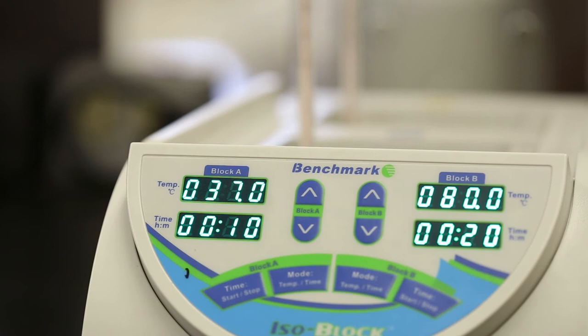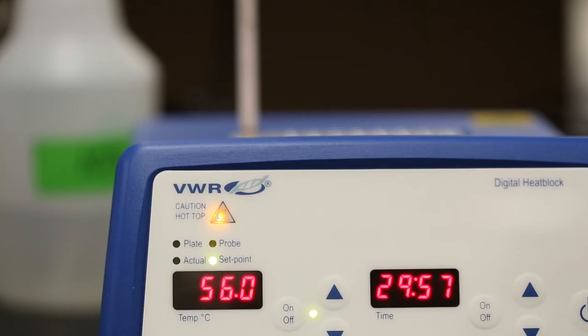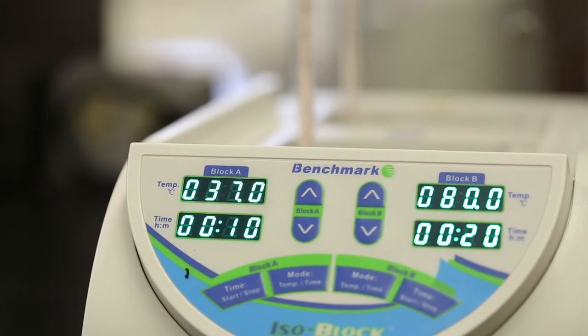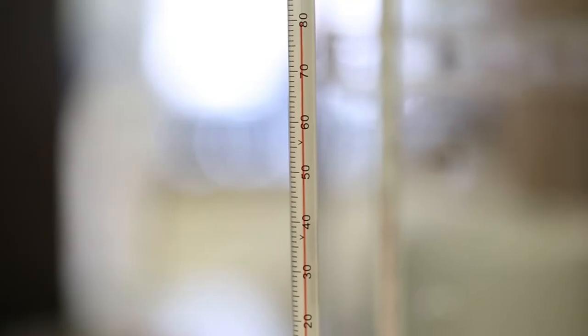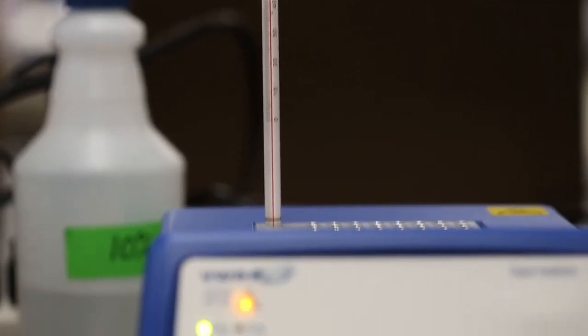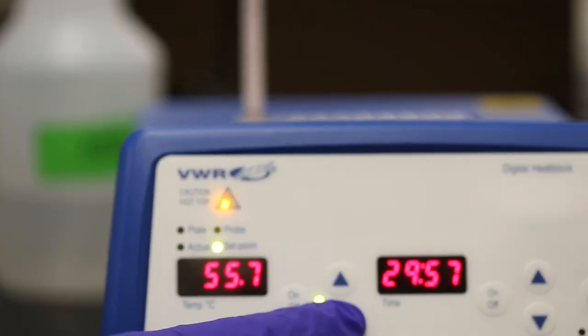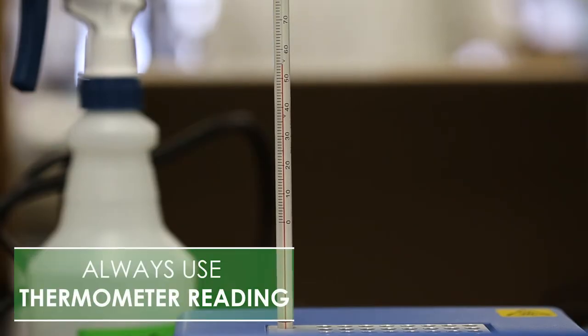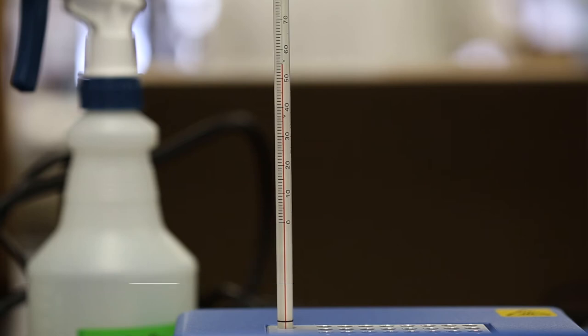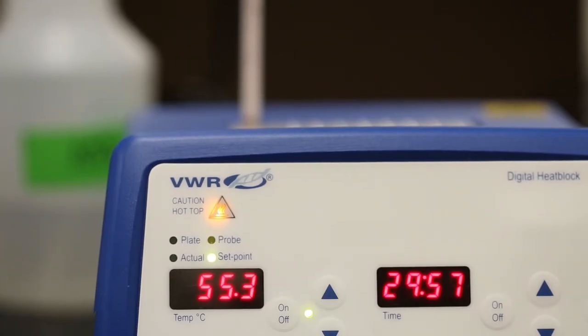Check the three heaters. They should read 37 degrees, 80 degrees, and 56 degrees Celsius respectively. If they do not, they may still be heating. If they appear to be done heating, indicated by a beep from the unit, check the thermometer in each block. If they do not read the appropriate corresponding temperature, adjust the heating block to within two degrees. Always go by the thermometer reading. Once the thermometer reaches the correct temperature, the heater will hold there even if the digital display varies from the thermometer setting.